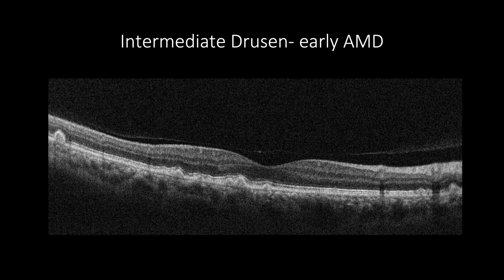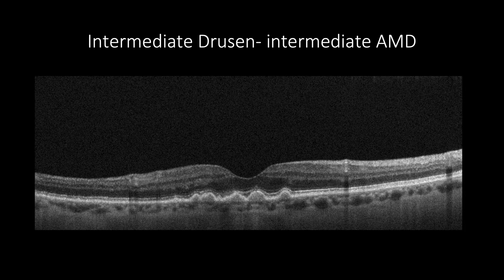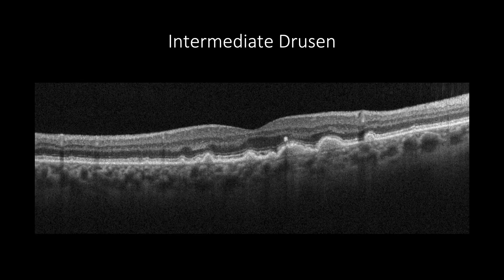Intermediate drusen are when the drusen size is between 63 and 124 microns, and can be responsible for early AMD when there is a combination of small and few intermediate drusen. However, when there are numerous intermediate drusen, then the AMD is staged as intermediate. Intermediate and larger drusen are usually called soft drusen, which appear with a more homogenous content and are associated with disruption of the ellipsoid zone, responsible for decreased vision. In contrast to hard drusen, soft drusen can be associated with intraretinal pigmentation, which appears as hyperreflective foci in the outer retinal tissues, which may cast shadow artifact in some cases.